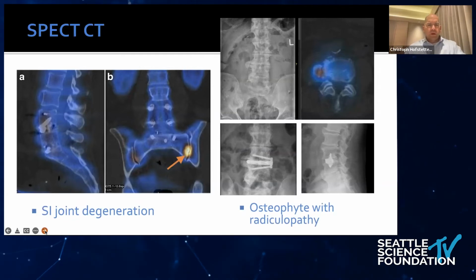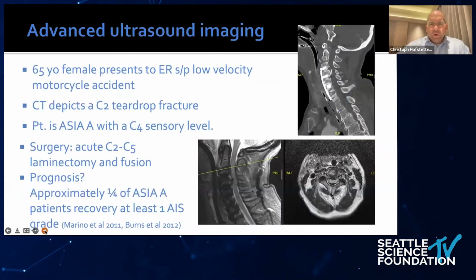So last point here that I want to make quickly, wanted to also present our work on ultrasound imaging. Well, you might say that this is not a directly minimally invasive application right now, but in a way it is, because it allows us to tailor the decompression surgeries in our acute spinal cord injury patients to the decompression that the patient needs. And I want to convince you quickly here that this really has changed our practice entirely at Harborview.